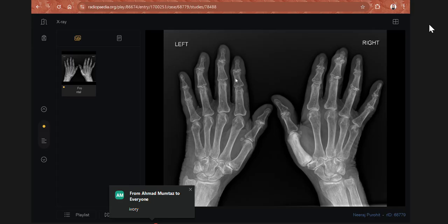If you focus on the trabeculae, do they appear normal or is there coarsening? No, sir, there is coarsening. There is a coarsening and the central areas of lucency. It can be, but although I'm not able to see any periosteal reaction and bone erosions, it can be septic etiology as well. But septic, I'm not sure about that because I'm not able to see any associated periosteal reaction or soft tissue expansion.